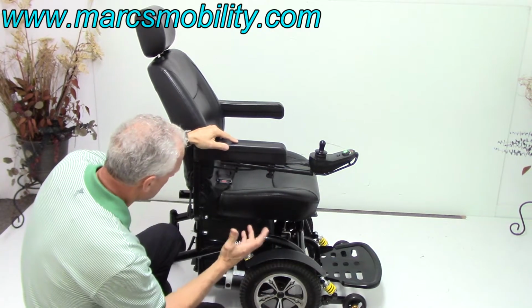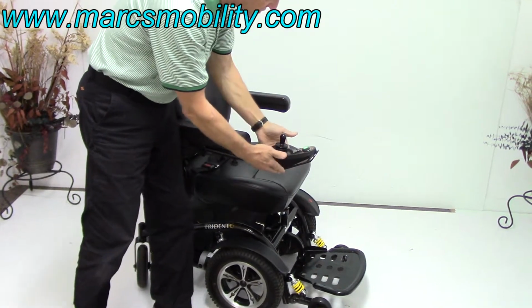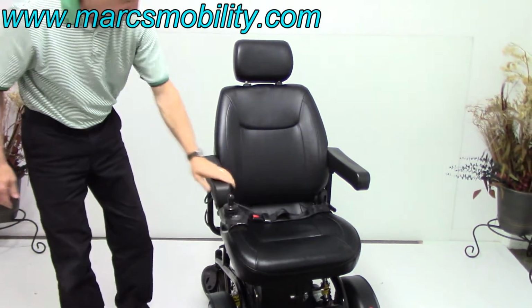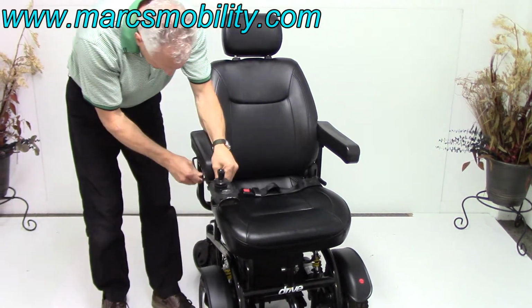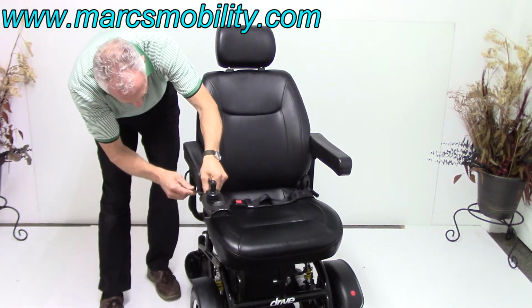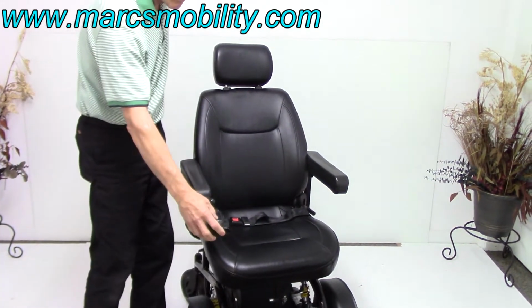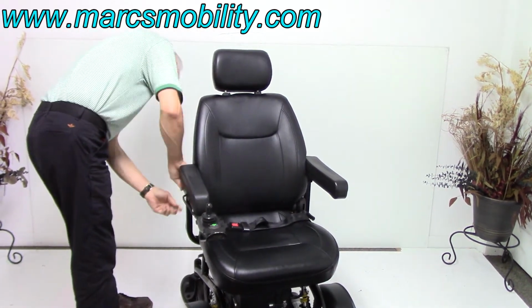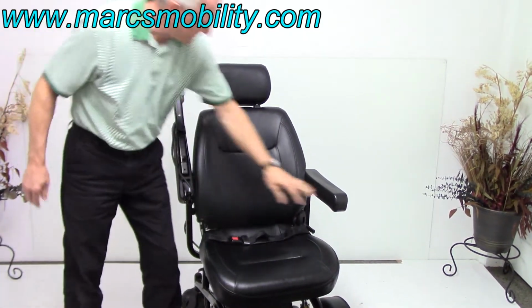So it's really a sharp looking power chair. The joystick has a protecting metal cover around it, which is nice. The arms do flip up. And we just disconnected the joystick. Okay, let me reconnect that. If I had my glasses, I could see better. There we go. Put the power back on. When I raised the arm, I disconnected the joystick. So this cable will have to be loosened up. There we go. So the arms do flip up.